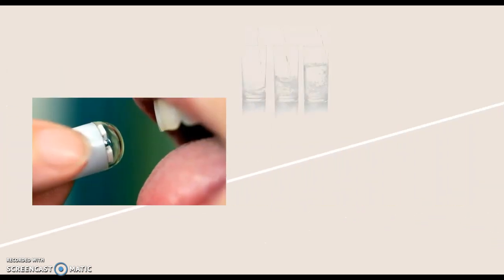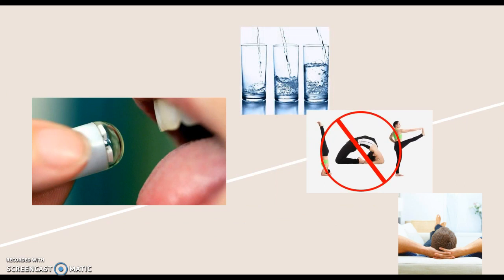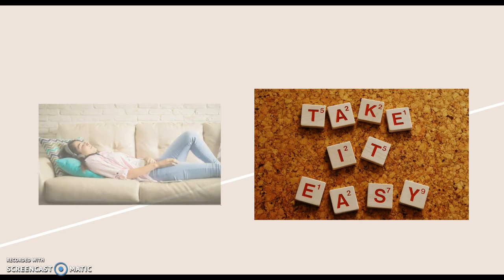Preparation for the capsule procedure requires patients to take the pill on an empty stomach, so having nothing to eat or drink for about 12 hours. It is suggested that individuals wait to drink clear liquids until about 2 hours after the procedure, and a light meal may be consumed after about 4 hours. Due to the possibility of medications interfering with the exam, patients are asked to stop or delay taking certain medicines until the procedure is complete or until the doctor follows up.